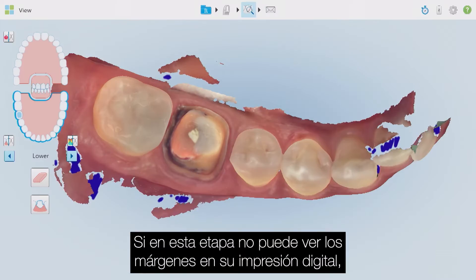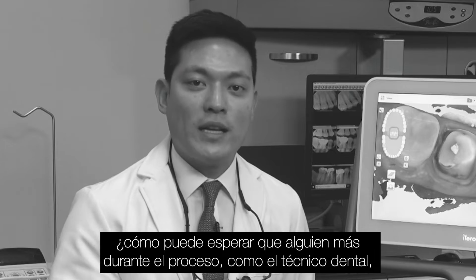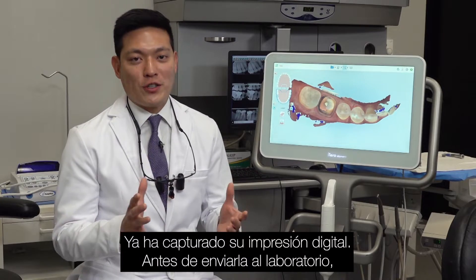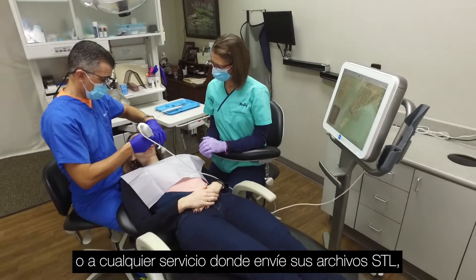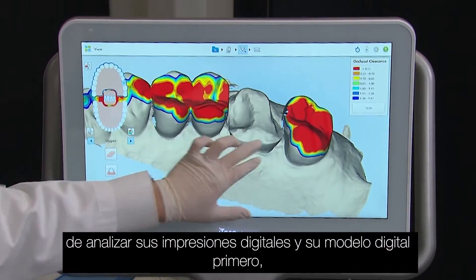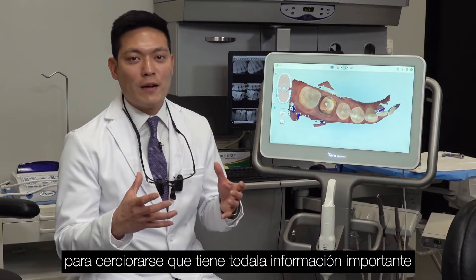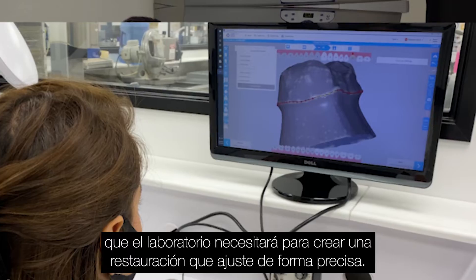If you cannot see the margins at this point on your digital impression, how can you expect someone else down the line — the dental technician — to know where to position the margins? So you've captured your digital impression. Now before you send it off to the lab or to whatever service you're sending the STL scans to, you want to make sure you analyze your digital impression and your digital models first to ensure that you have all of the critical data points that the lab will need to create a precise fitting, accurate restoration.